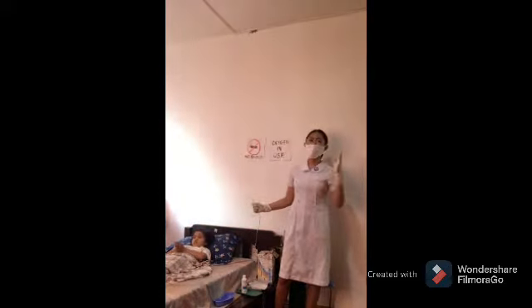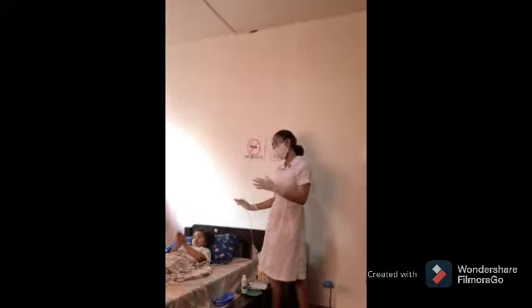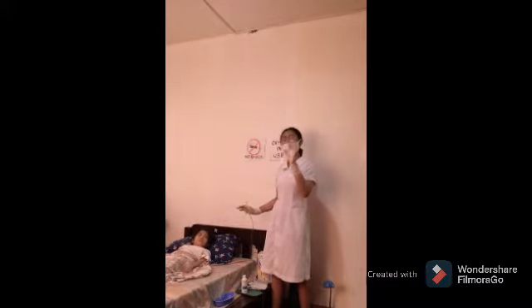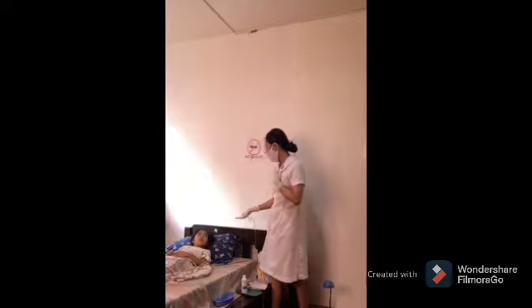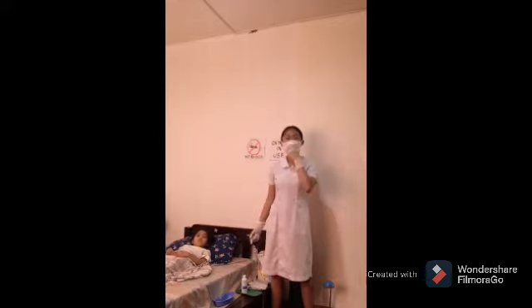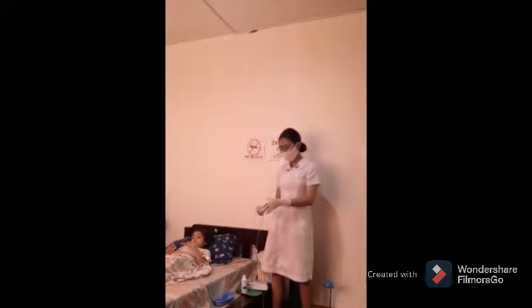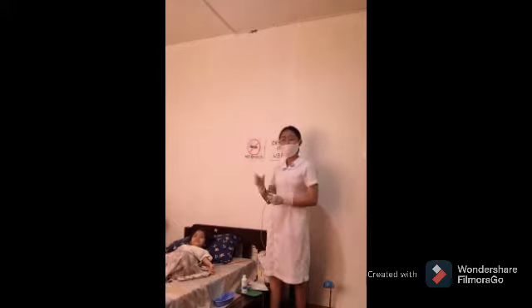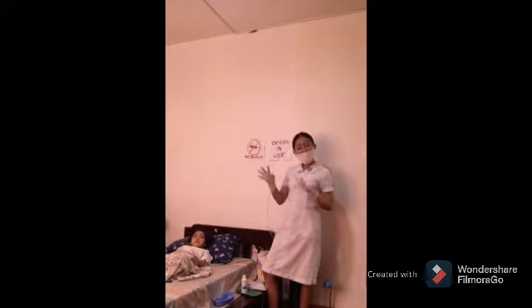Using our non-dominant hand, we will ask our client to take deep breaths several times. After that, we will flush our catheter with saline solution to check the effectiveness of our suction machine — if it is suctioning, then the catheter is working properly. We will allow a 30-second to one-minute interval between each suctioning, and encourage the patient to breathe deeply after every pass.